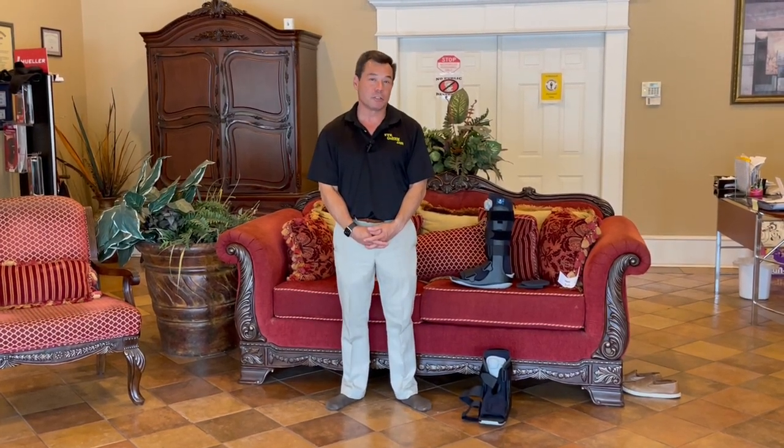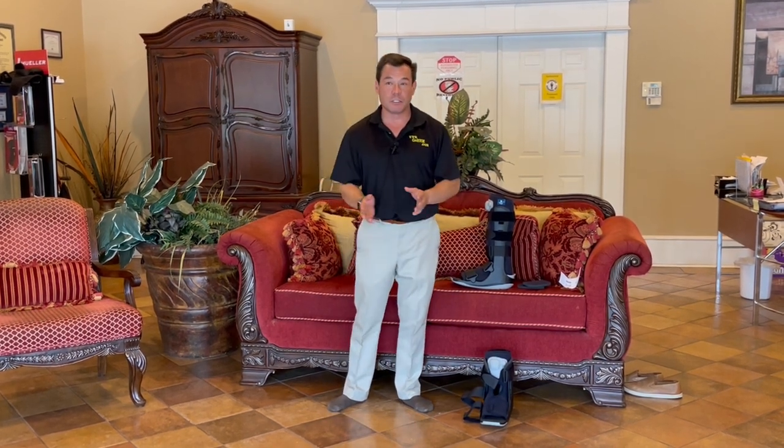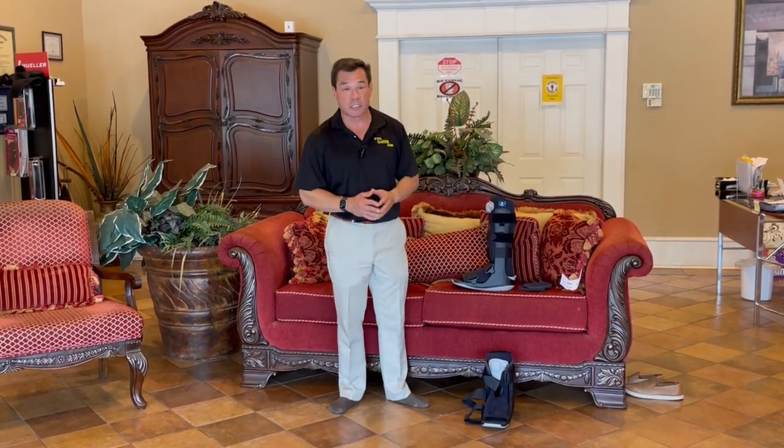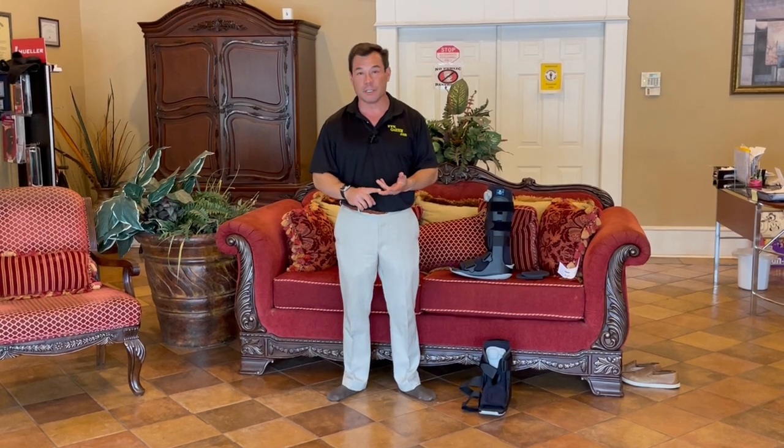Hello, I'm Jeffrey and once again we're here at Habibi's Home Medical and Habibi's Durable Medical. Today we're going to be talking about something that's actually pretty exciting to me: walking boots. Now in the past we've shown you some other equipment — things like crutches, walkers, rollators.